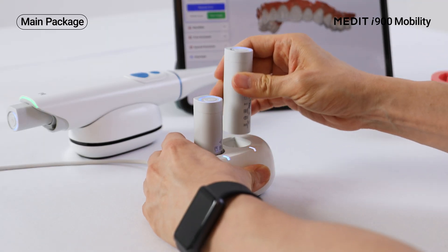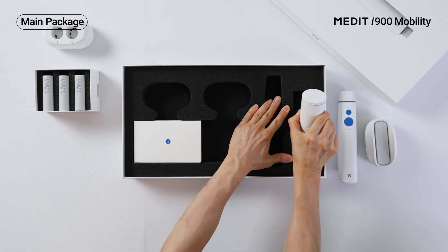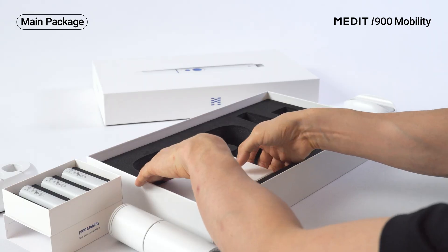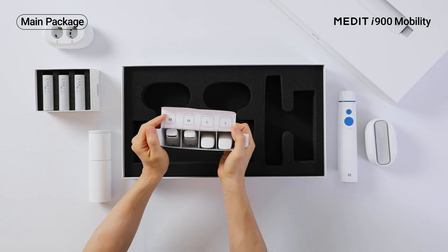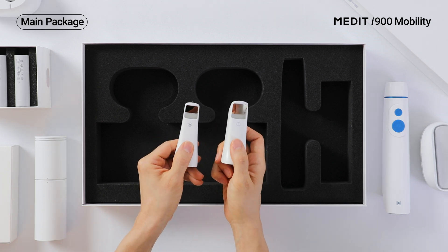The battery has a button and LED indicators allowing you to check the remaining charge even when it's not connected to a device. The package also offers a calibration tool and scanner tips for precise scanning. There are four tips in two sizes for use in various situations. The large tip is especially useful for capturing more area in a single scan.